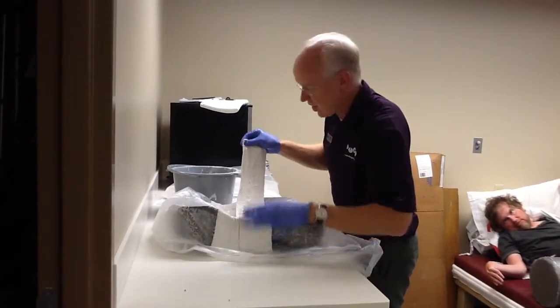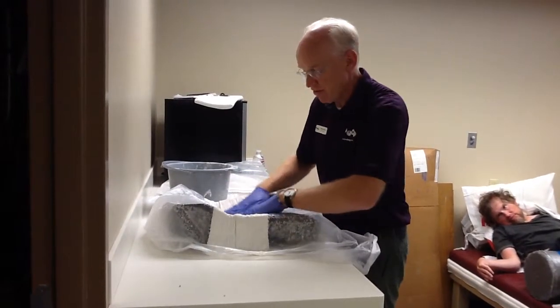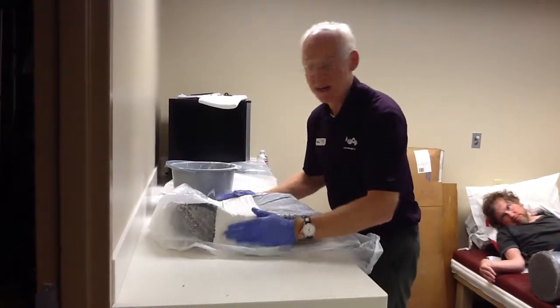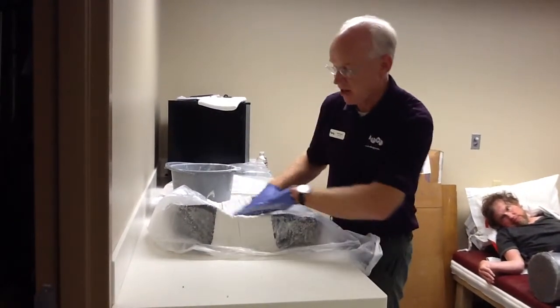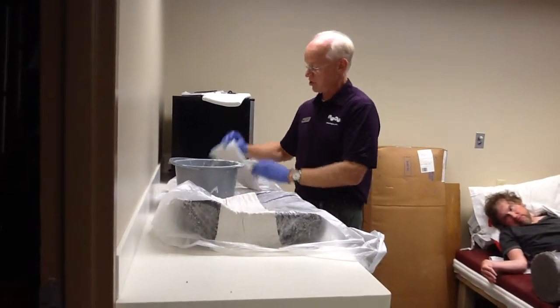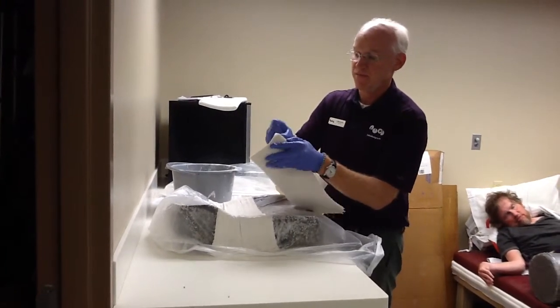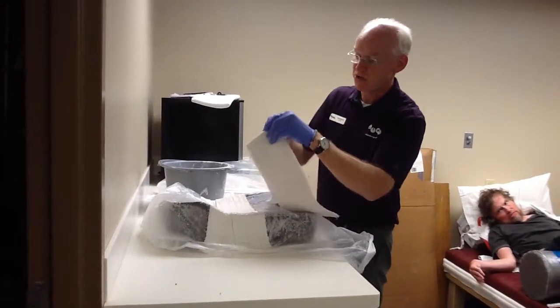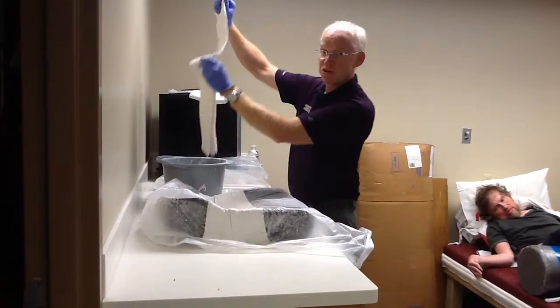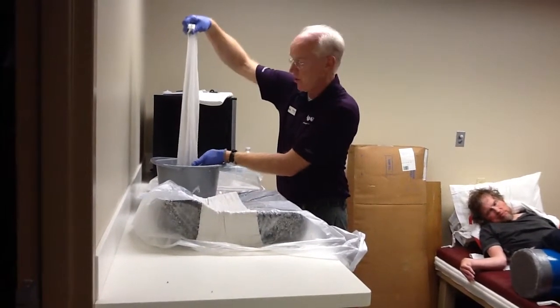The whole idea is if you've got a cushion that's working well and you're replacing it for reasons other than fit, there's no better representation of a good, safe loading contour than a cushion that's been sat on successfully for a period of time. As the Ride Custom Cushion morphs to the subtle changes that a client presents with — whether it be small postural changes, weight loss, weight gain — the material of the Ride Custom Cushion changes too, so that loading contour actually becomes more accurate over time.